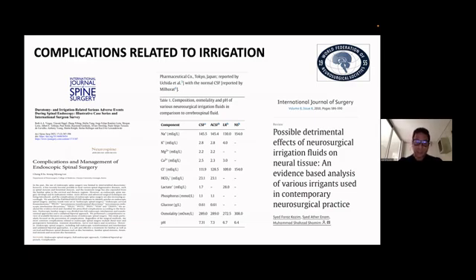The reason could be the endoscopic spine system that I use, and the fact that I control the pressure and the fluid frequently during the whole surgery. I have had, of course, complications like bleeding, infections, and opening of the dura, but until now, none has been a serious complication during endoscopic spine surgery.